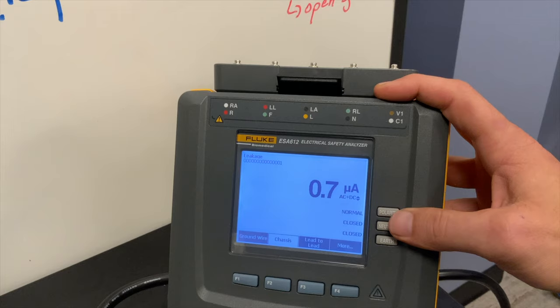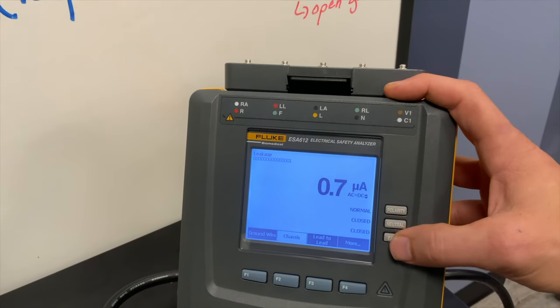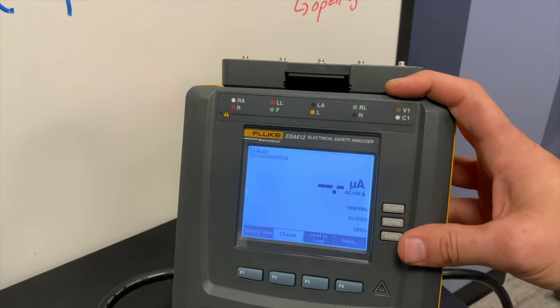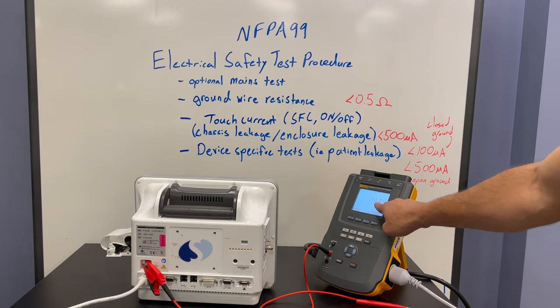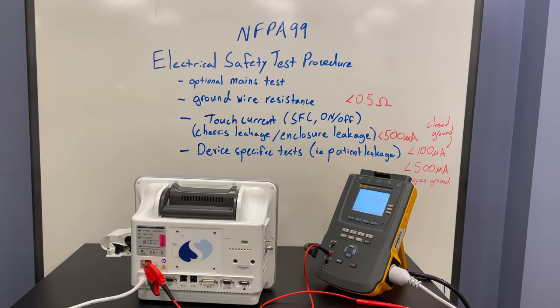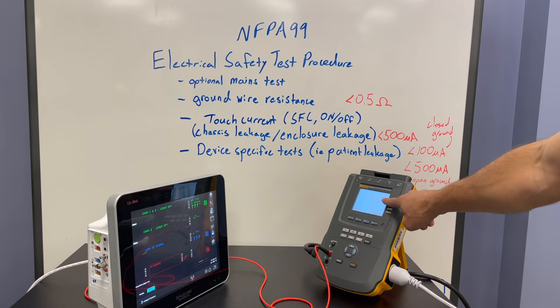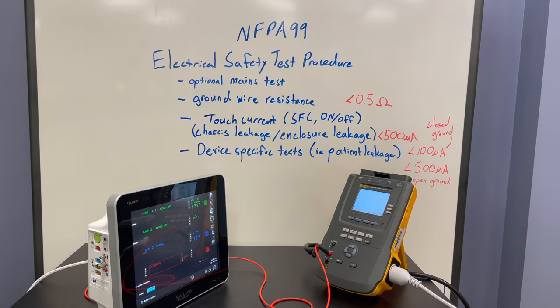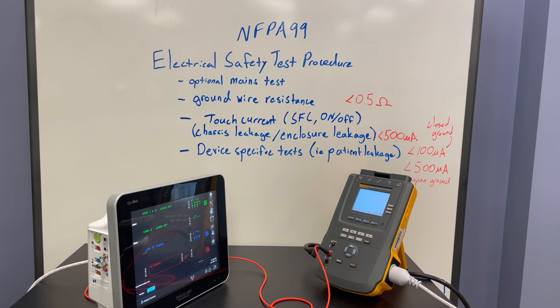Next we're going to test in the single fault condition — neutral closed and earth/ground open. Now I have to make sure I turn the device on and off during this test. With the single fault condition and the on/off switch cycled, the leakage current is kept below 500 microamps, so this passes the touch current test.